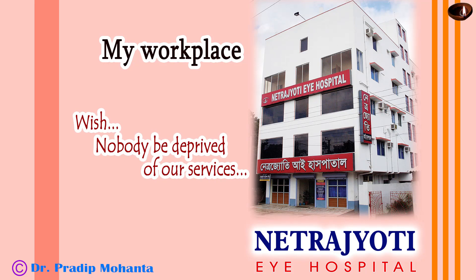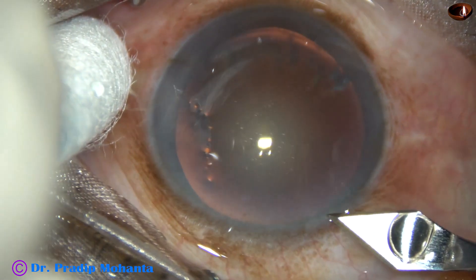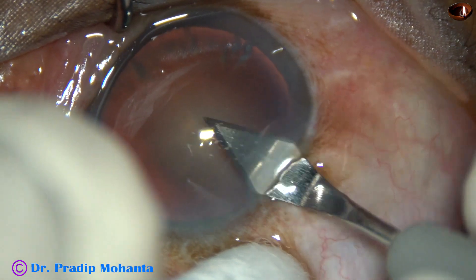Friends, welcome to my workplace at Ranaghat, West Bengal, India. This is phacoemulsification of a soft cataract. This is a totally unedited surgery. Let us observe the surgical steps.